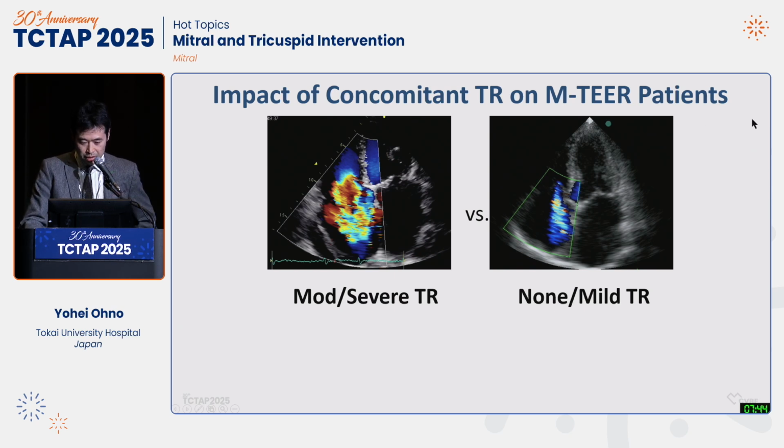So when I started my journey of mitral TEER more than 10 years ago in Catania, Italy, one of the clinical questions that I had was, how should we deal with patients who have significant TR when undergoing the mitral TEER procedure? As you know, some of the patients actually have significant TR at the baseline.